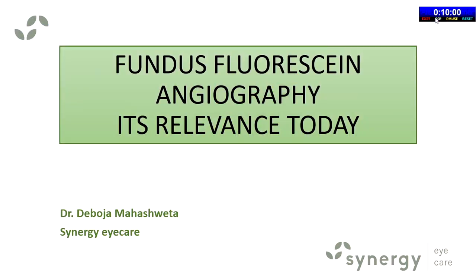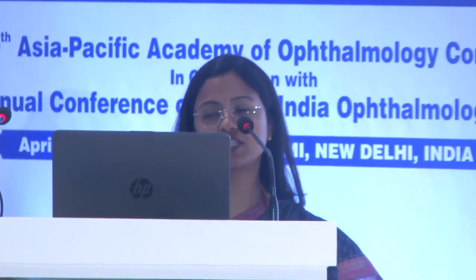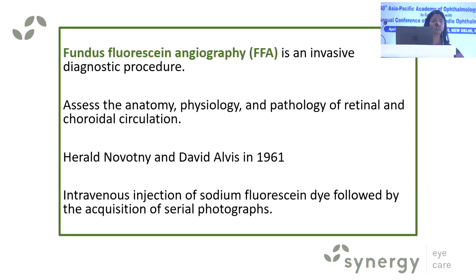Good afternoon, everyone. So let's begin with fundus fluorescein angiography and its relevance today. Fundus fluorescein angiography, or FFA, is an invasive diagnostic procedure which helps us to assess the physiology and pathology of retinal circulation mostly. Its clinical use in ophthalmology was first developed and discovered by Harold Novotny and David Alvis in the year 1961. It basically involves intravenous injection of a dye, sodium fluorescein, followed by the acquisition of serial fundal photographs.